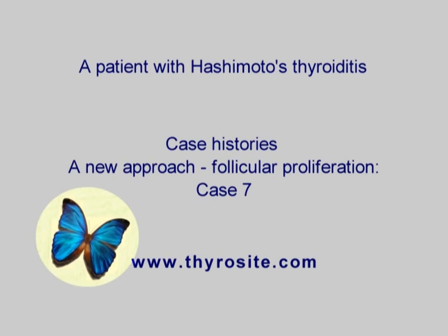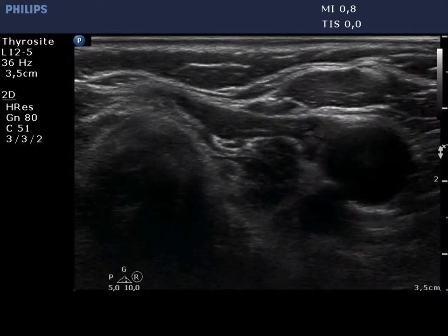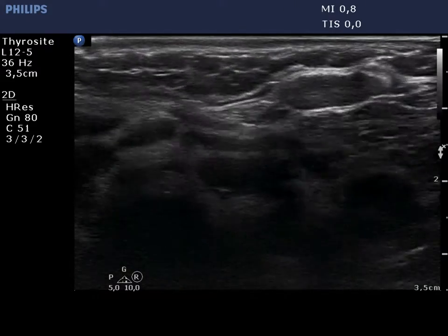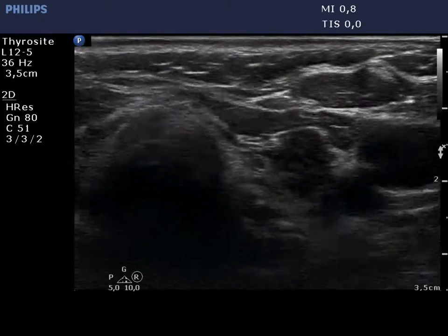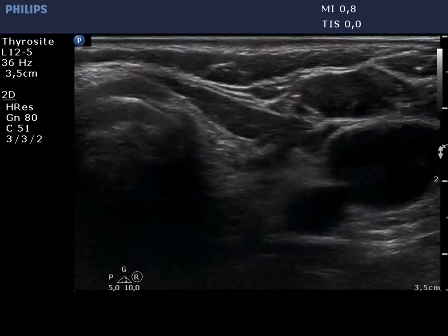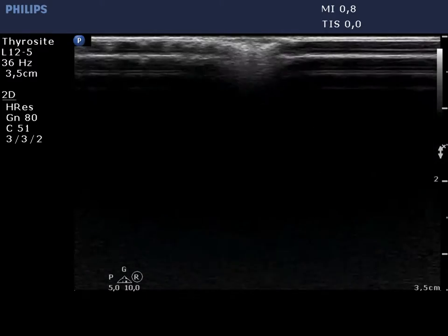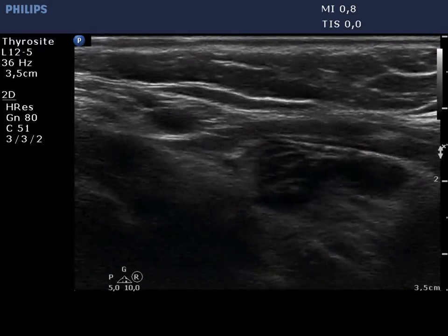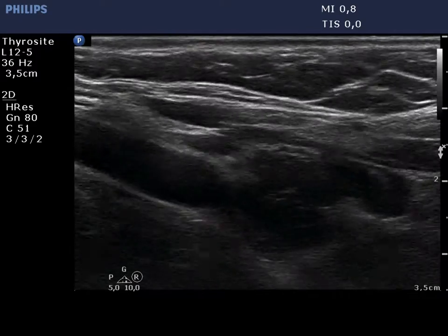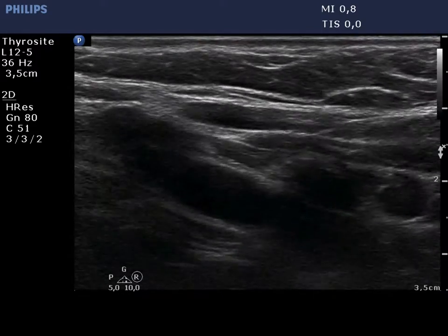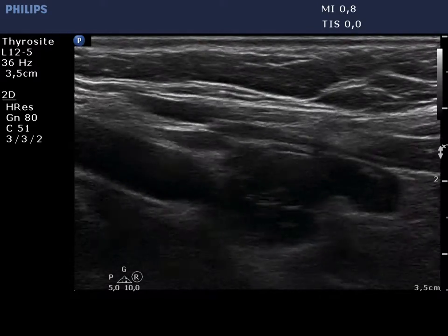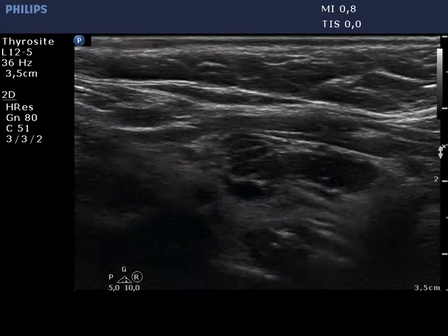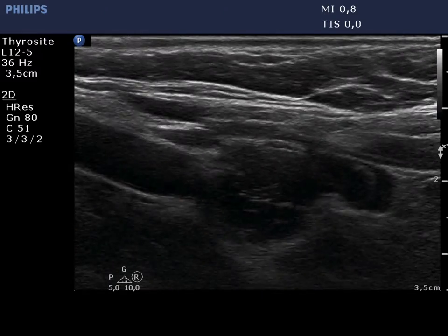The left thyroid lobe is presented. The lobe is composed of a central hypoechoic area surrounded by a less hypoechoic rim. The hypoechoic part consists of discrete hypoechoic areas divided by connective tissue.